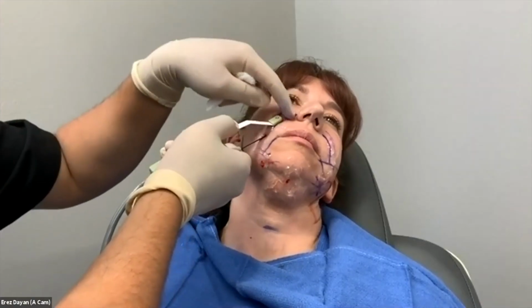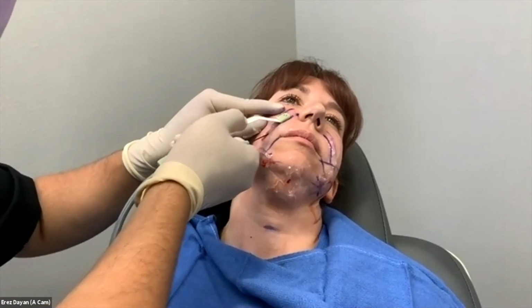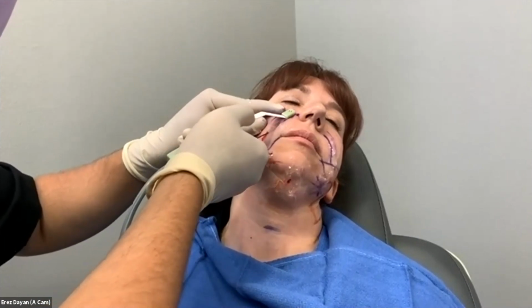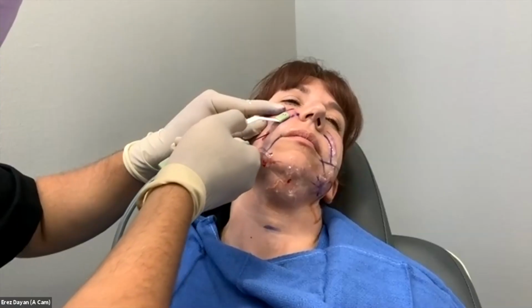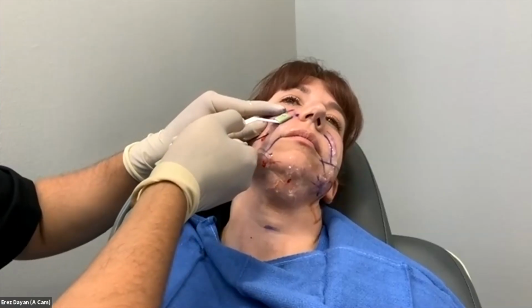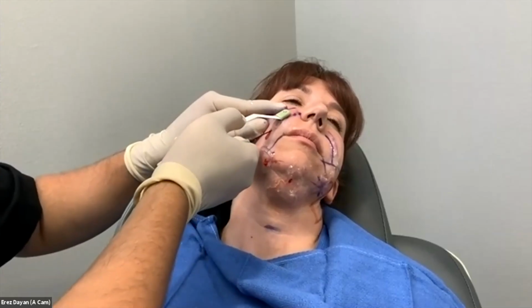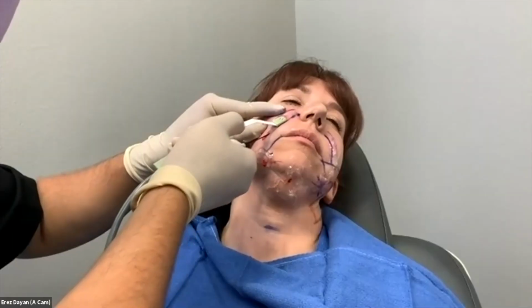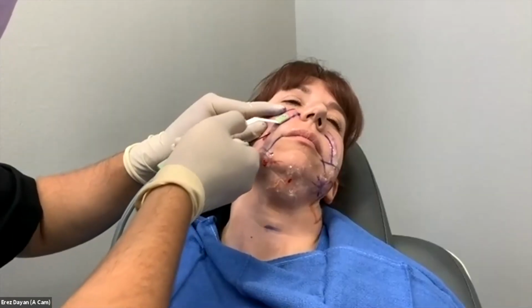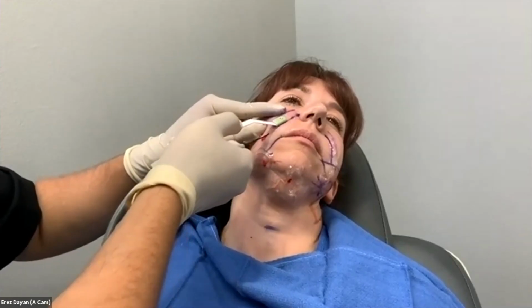You see how my lower limit is the dotted line. So now we've reached external temperature. So I'm just going to hang out here for a couple seconds, 30 seconds or so. I'm pretty deep. I'm cantilevering down. 1 row, very easy. So you could do these all day, you know, nasolabial.